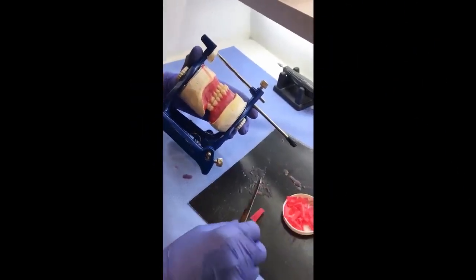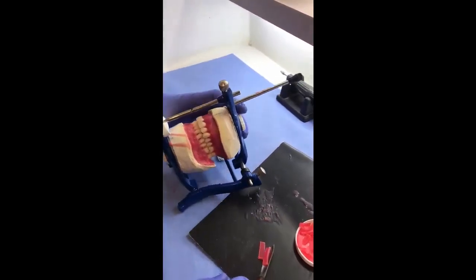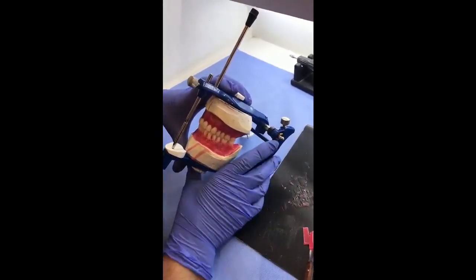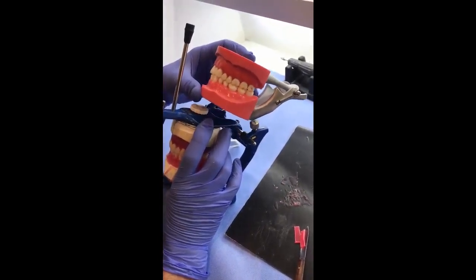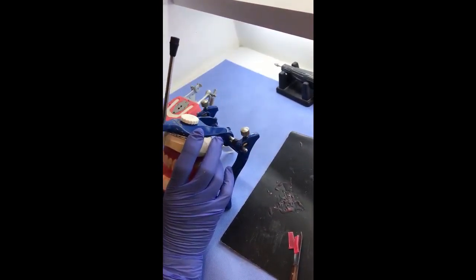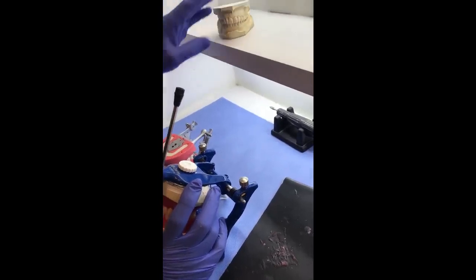Now the waxing up is the process of carving the denture base to simulate the contour of the natural tissues which are being replaced by the denture. It is a sort of decorating the trial denture to the final shape. Now, you can use a study model like this one to observe the contour of the surrounding tissues, so you can mimic the same appearance, or you can use study models like this one where you have the anatomical landmarks clear, so you can do something similar.